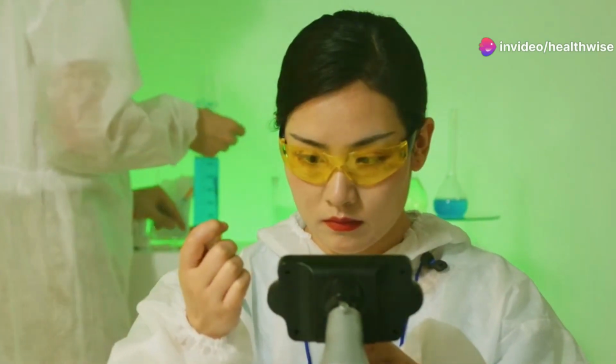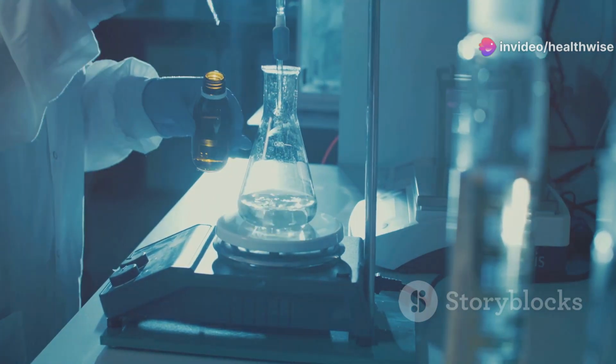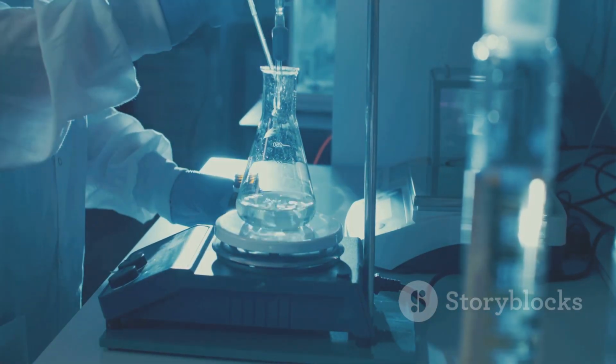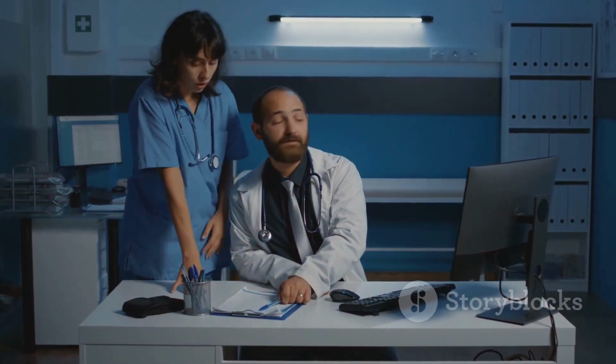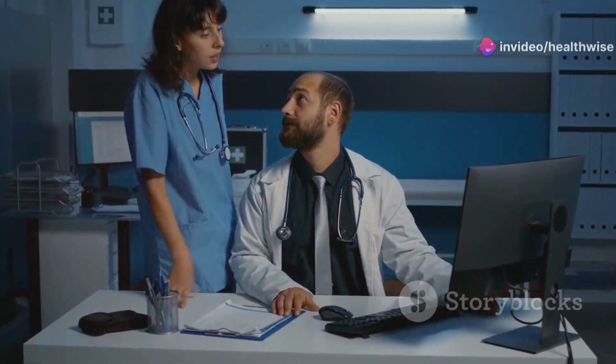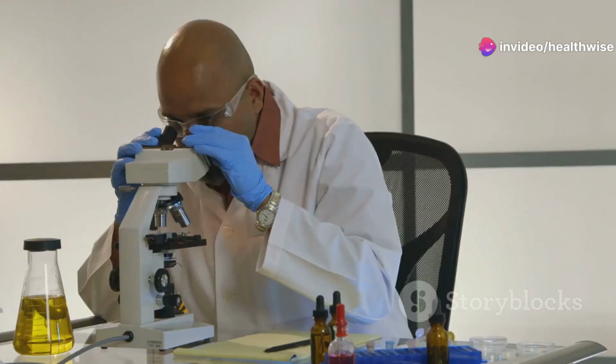Hey there, future doctors! Today I'm diving into the fascinating world of parasitology. Specifically, I'll be explaining how to detect parasites using 3 top concentration methods. These techniques come in handy when parasites aren't visible in direct saline preparations, but are still suspected based on symptoms or clinical history. Let's get started.